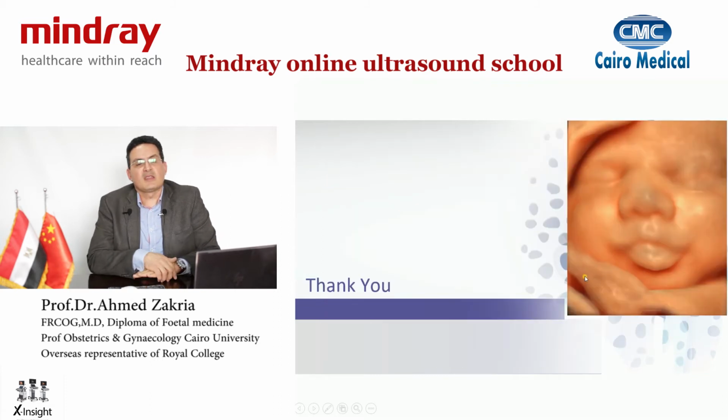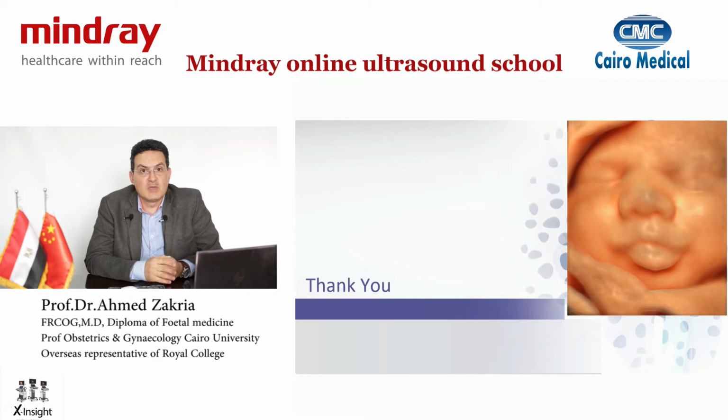Okay, thank you for your attention. We're going to take a few minutes of a break so that we set up the live demo. And in the live demo, I'm going to show you how we're going to move across the volumes, how we're going to obtain sweeps across the baby, how we're going to adjust that, and accordingly take it from that point onwards. I'll meet you again in a few minutes.